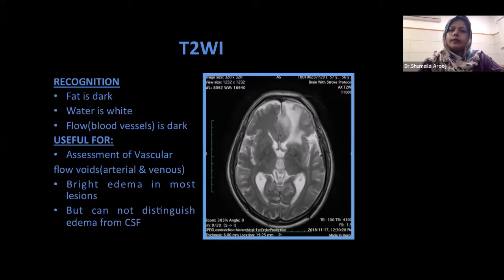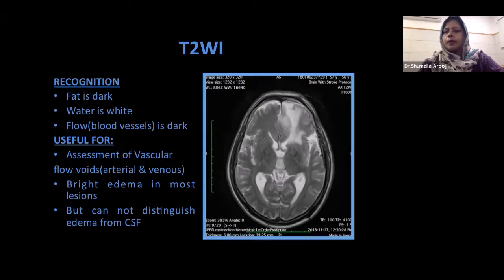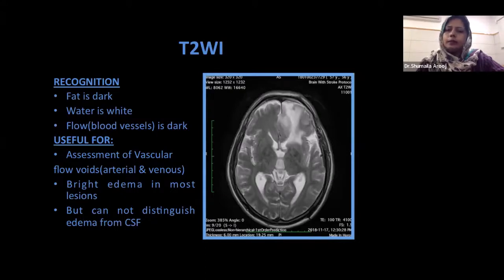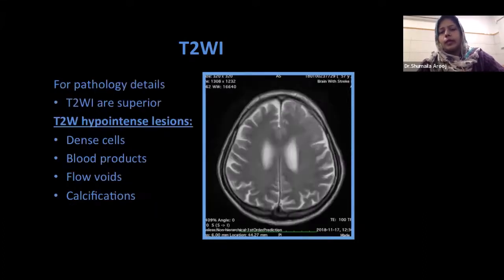Then we come to T2-weighted images. We know that fat is relatively darker compared to T1-weighted images. Gray matter becomes white, white matter becomes gray, and fluid becomes bright — it is all the reverse of T1-weighted images. Whatever we saw on T1, on T2 everything becomes reversed, and pathological edema becomes very prominent. We look for vascular flow voids on this. The bright edema is seen in most lesions, but in these images we cannot differentiate edema from normal fluid.